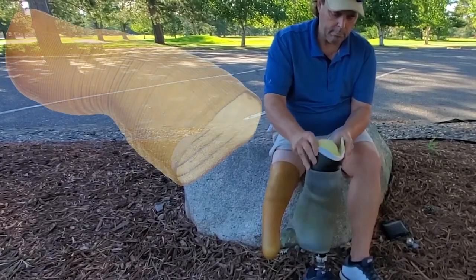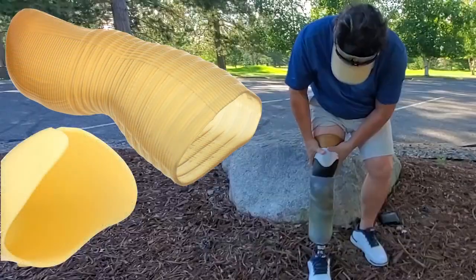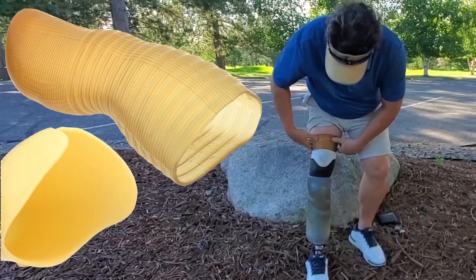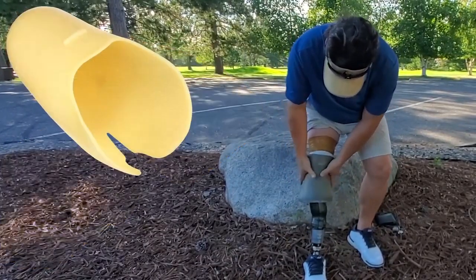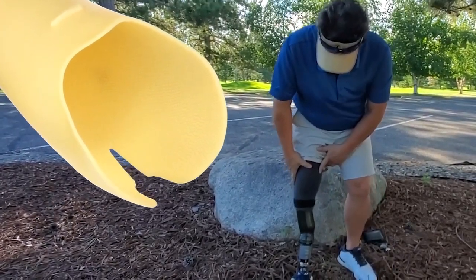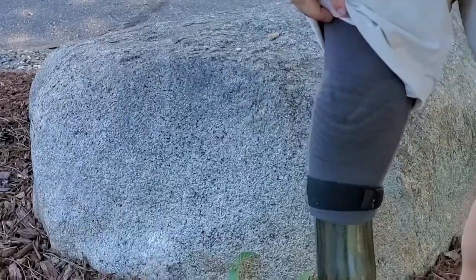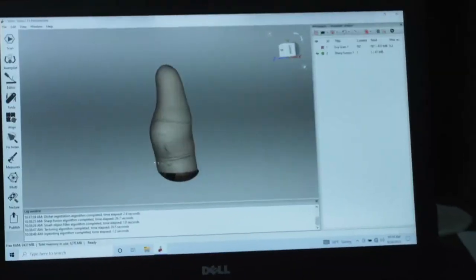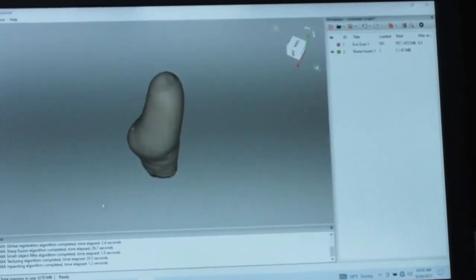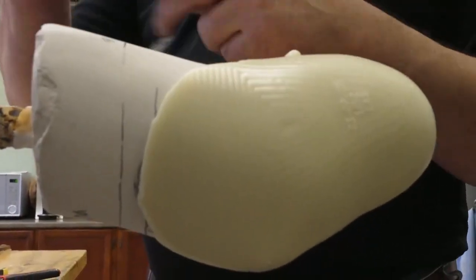My leg goes into a urethane liner which then goes into the EMS socket. The EMS socket is contoured and fits that liner perfectly, but it's dimpled in such a way that when the vacuum takes place it pulls that liner outward into the EMS and locks me in incredibly tightly. We take a scan provided by the prosthetist, convert it into a mold, and build the entire system here.